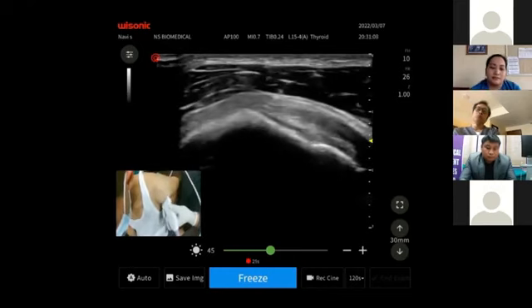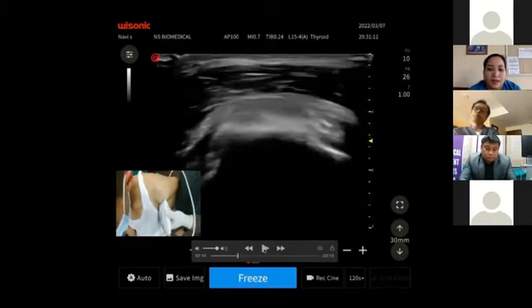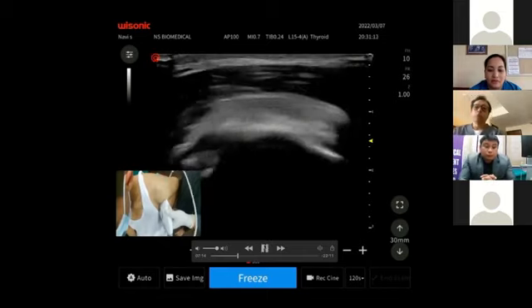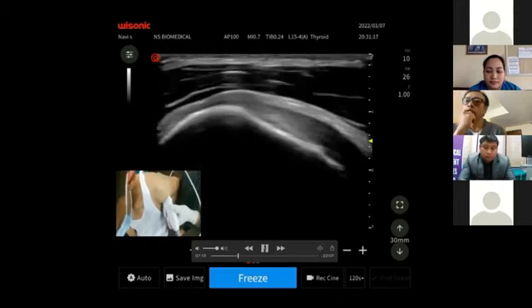So what this maneuver does is it brings out the supraspinatus muscle from under the acromion complex. I just like to highlight that the position of the patient for evaluation of the supraspinatus muscle is a modified crass position in which the patient reaches his hand for the back pocket, and the elbow is flexed and the shoulder is extended. So it appears as a bird's beak appearance.